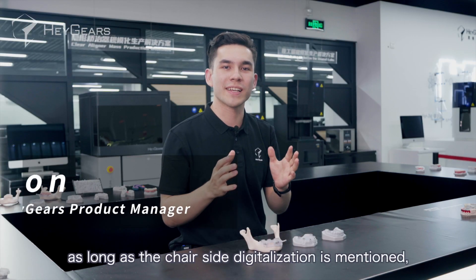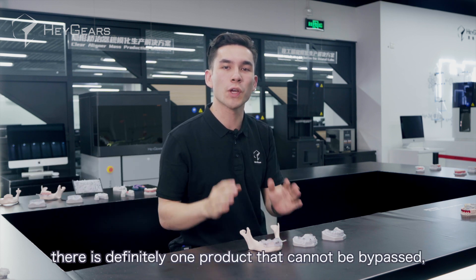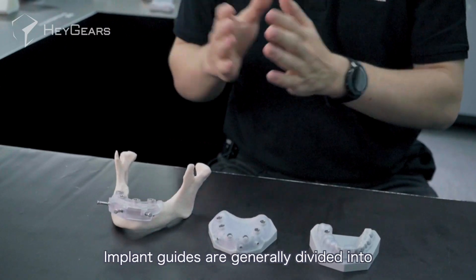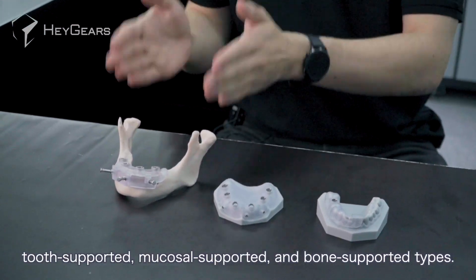At present, as long as chair-side digitalization is mentioned, there is definitely one product that cannot be bypassed, which is the implant surgical guide. Implant guides are generally divided into tooth-supported, mucosal-supported, and bone-supported types.